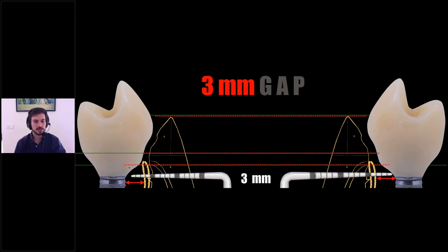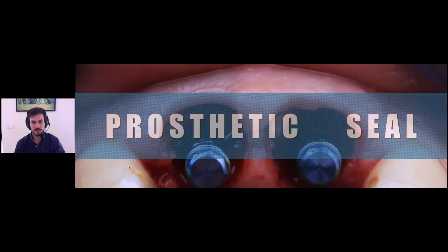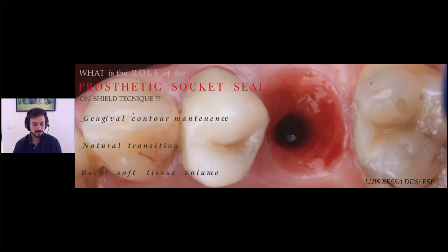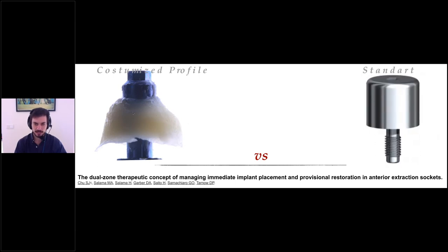protect our roots. So the prosthetic seal is really important for me to maintain all the architecture of our alveolus, or to maintain the gingival contour, to have a natural transition at the end of the treatment between our prostheses and pink soft tissues, and to have buccal soft tissue volume adequate to our restoration. So therefore, customized profiles at the time of the surgery are always better than standard profiles.